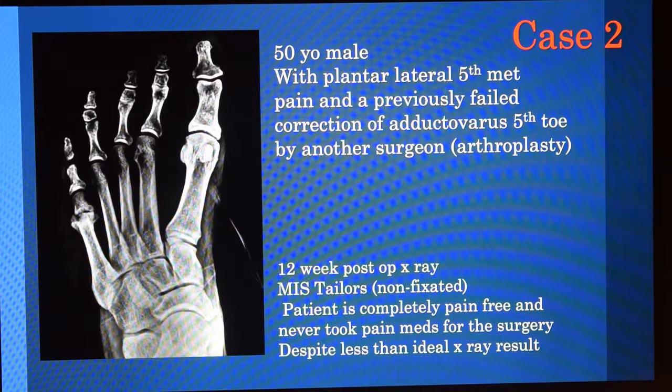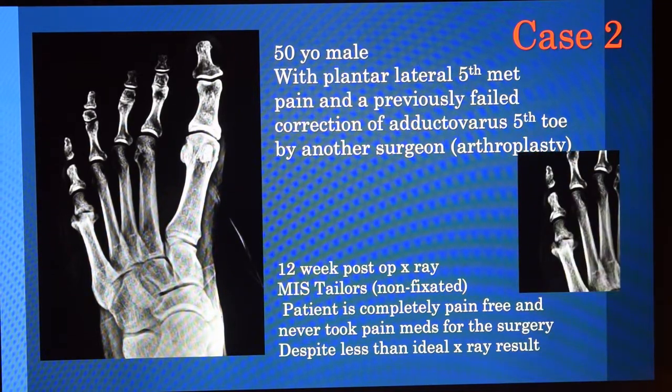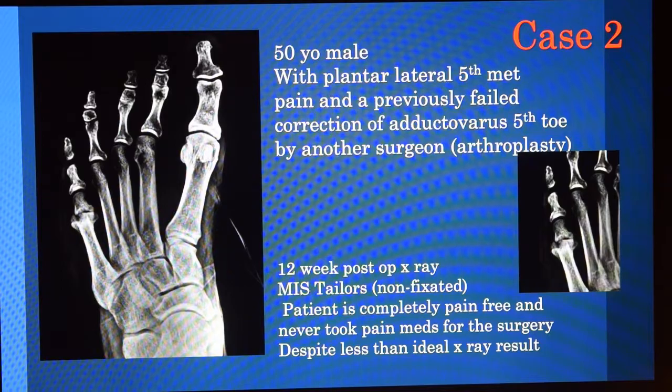This is a 12-week post-op X-ray. His MIS Tailor's was non-fixated. Patient is completely pain-free, never took pain meds for the surgery, despite less than ideal X-ray results. This will actually go in and consolidate or just form a fibrous union here that will never be an issue for the patient.